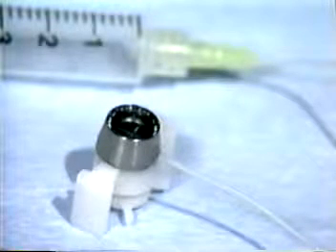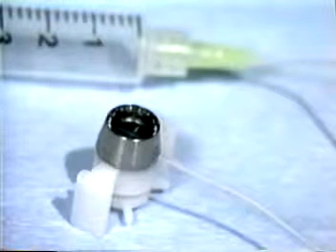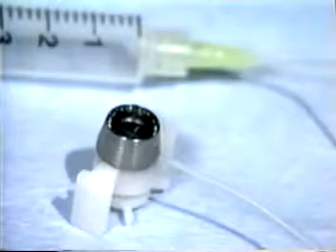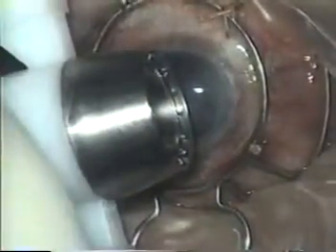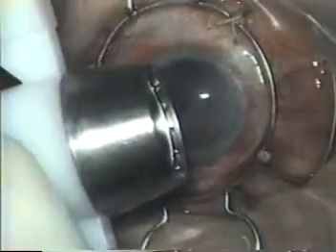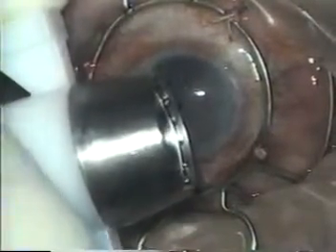The Barron radial vacuum trephine is available in diameters of six to nine millimeters in half millimeter increments. Cutting and marking the recipient cornea with the trephine requires only a few simple steps. Before the surgeon places the trephine on the cornea, the edge of the blade is aligned with the bottom of the inner wall of the vacuum chamber. This position on the blade is called the zero position.